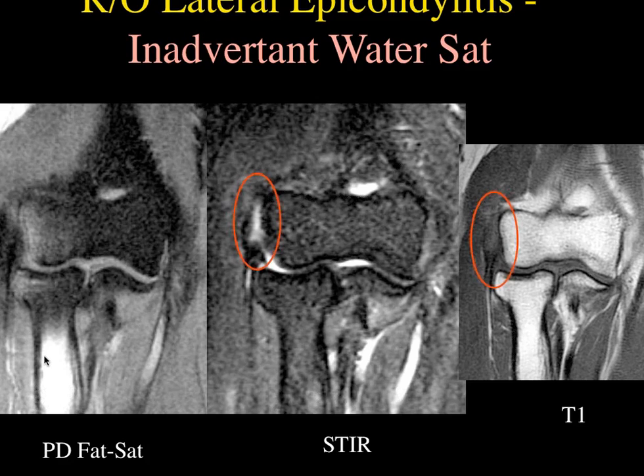I'm still confused. Are we changing the field of view? The field of view, like the size of the image, looks the same. So it is the same. What we're changing is from PD to the stir. I mean, besides the characteristics of a stir versus PD, why do we have a smaller field of view? Generally we do a PD, and then if it's a larger field, I thought we did stirs. No, that's not true. You use both of them with the same fields of view. It has nothing to do with field of view.